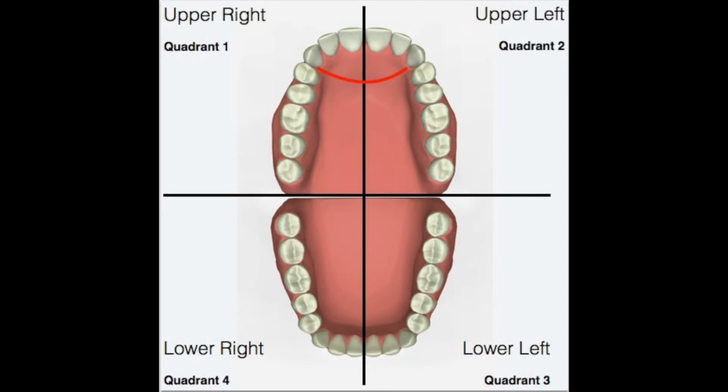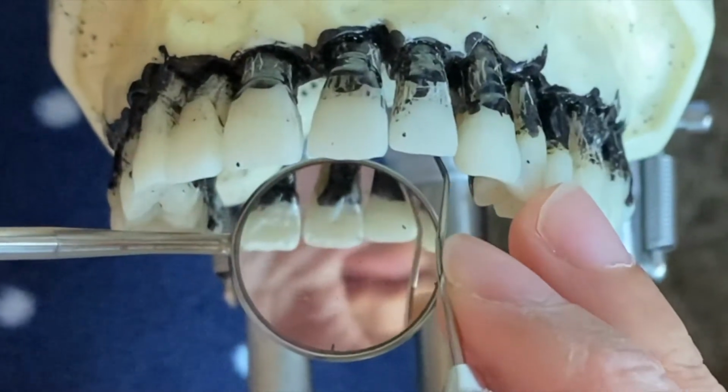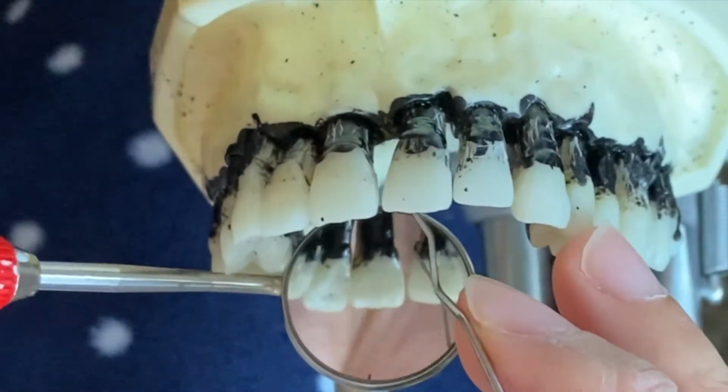Now we'll be working on the lingual surfaces of the maxillary anteriors, and I'll be starting with the surfaces toward. And I'll have my patient just face forward, and I'll be sitting at 8 o'clock. I'll be starting at the midline of 11 and working my way towards the mesial surface. I'll be doing that all the way to the mesial of number 9.